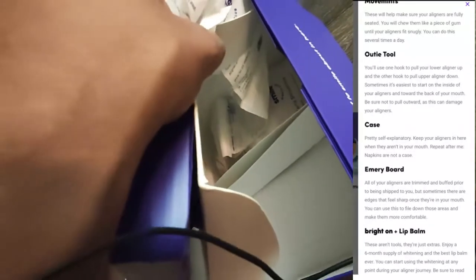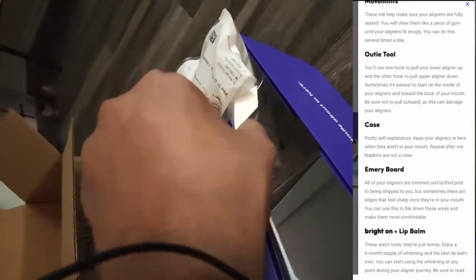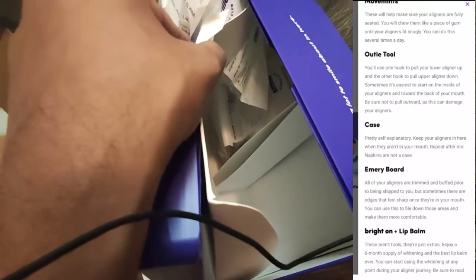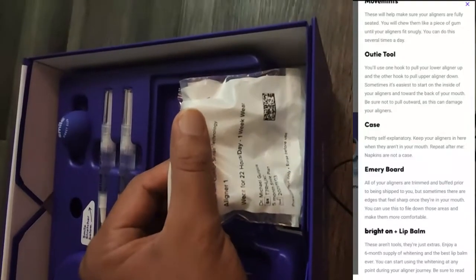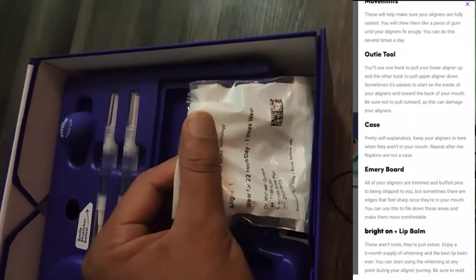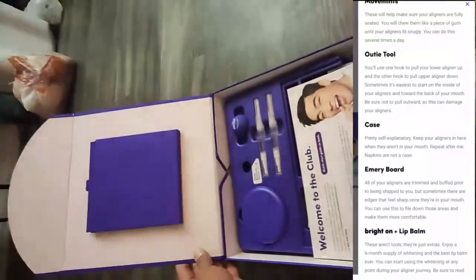So those are all the accessory items in the box. Apart from those, I received a total of 15 aligners, which I have to use over five months. Some aligners I wear for one week and some for two weeks. All 15 aligners are in separate packages, and on each package the aligner serial number, the number of weeks, and the daily hours I need to wear them are written.